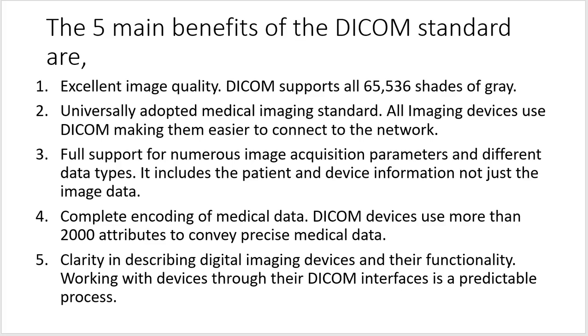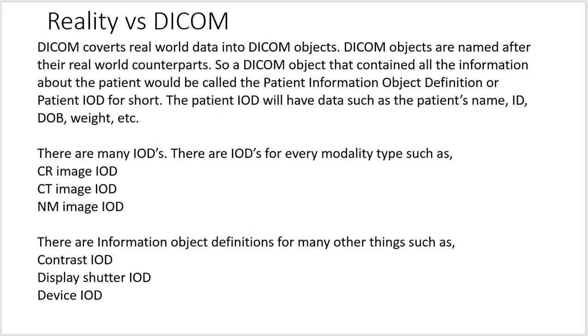Clarity in describing digital imaging devices and their functionality. Working with devices that are DICOM interfaces is a predictable process. That really means that an ultrasound scanner always behaves like an ultrasound scanner. As soon as you look at the DICOM information, you know you're dealing with an ultrasound scanner or a CT machine or an MRI machine.